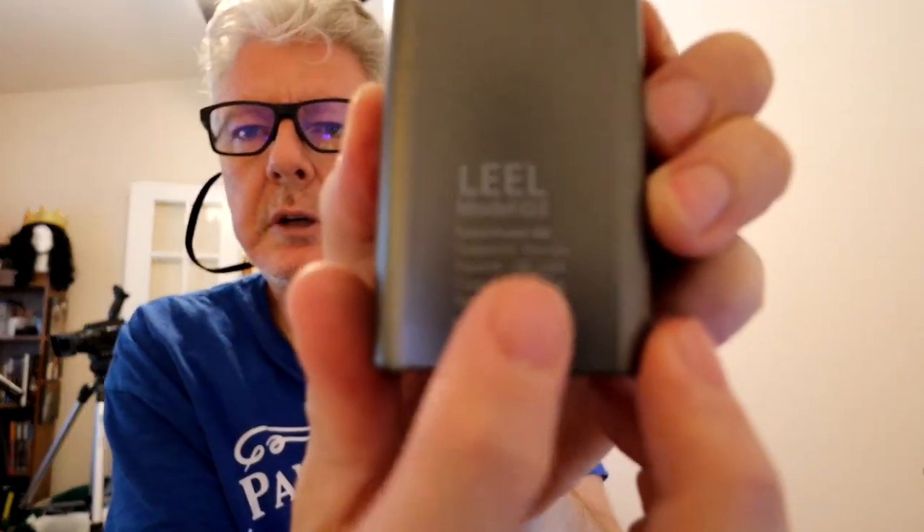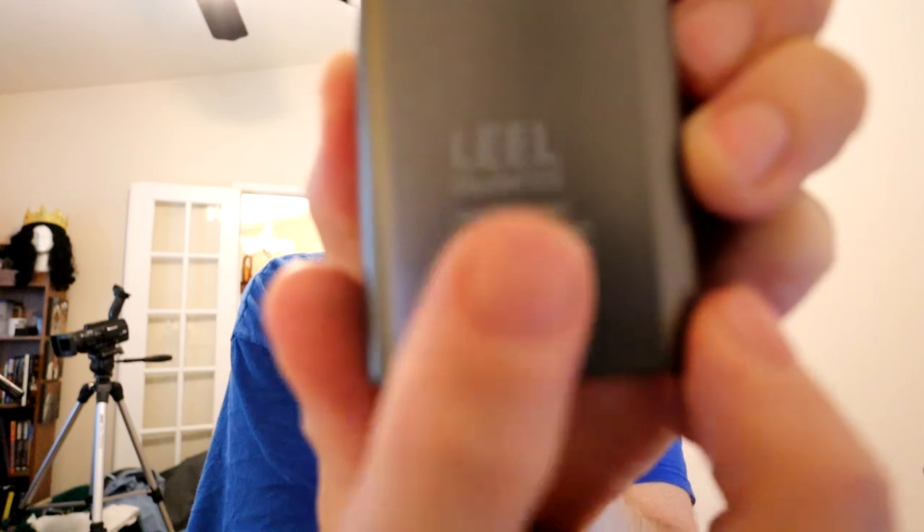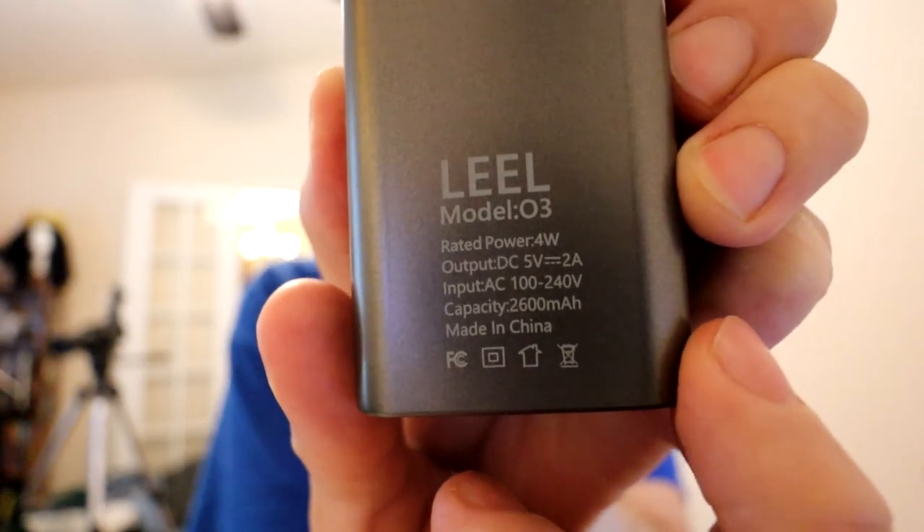This is the Leel Model O3, if you can see it right there. There we go. So we're going to give this a shot and see how it goes. Thanks to the good people at topcpapcleaner.com for supplying this for me, and we'll give it a review and see how it works.